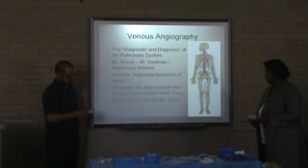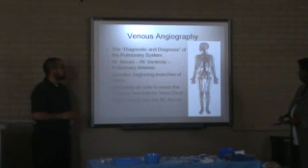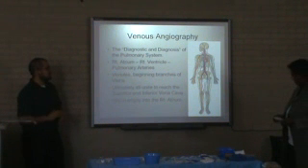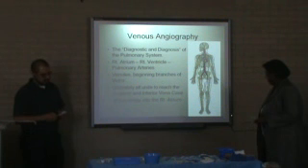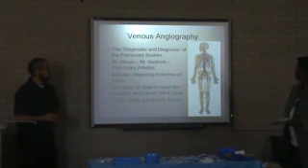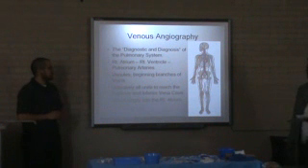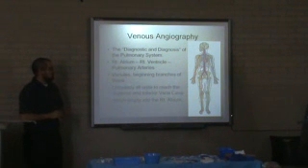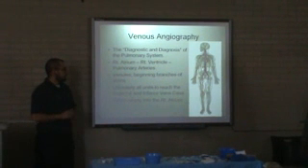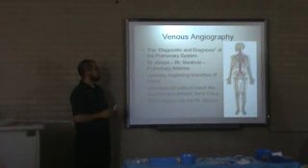Okay, venous angiogram. So venous angiography is actually the diagnosis of the pulmonary system, which includes the right atrium, right ventricle, the pulmonary arteries, and the veins, which ultimately all unite to reach the superior and inferior vena cava, which empties into the right atrium where they all began.